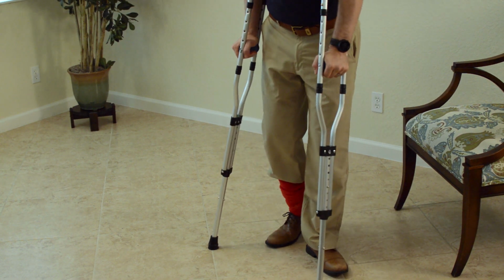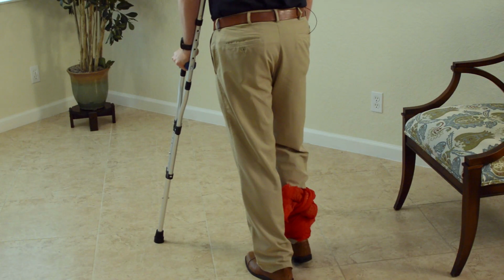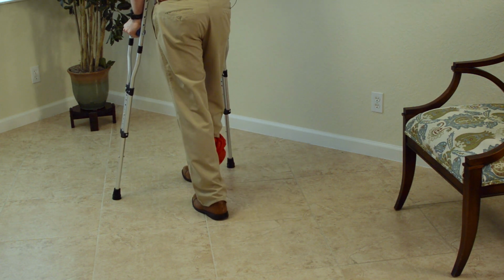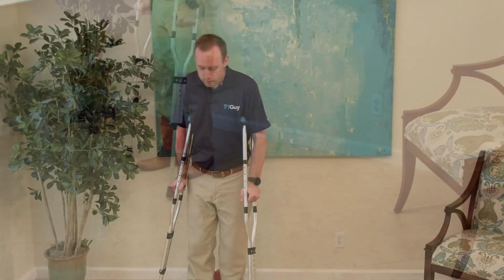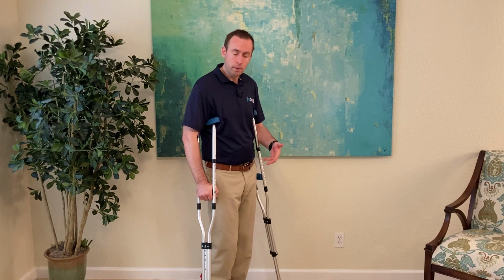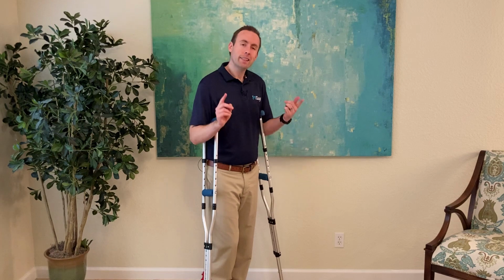And on a turn, it's the same thing. You're just doing one of these, all right? So it goes crutches, hurt foot, put the weight through your arms, left foot. Crutches, hurt foot, arms, good foot, okay? So that's how you walk with crutches if you can put some weight through your leg. Now, what if you can't put any weight through your leg? What do you do then? What's the safest way? Let's do that next.